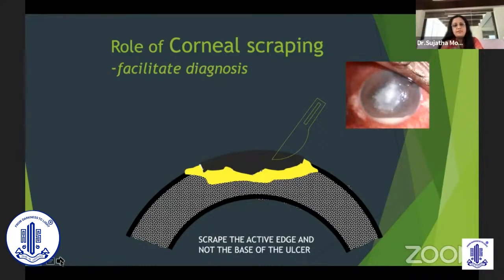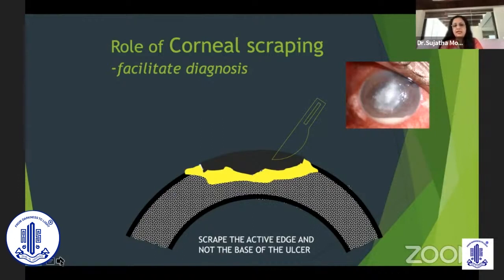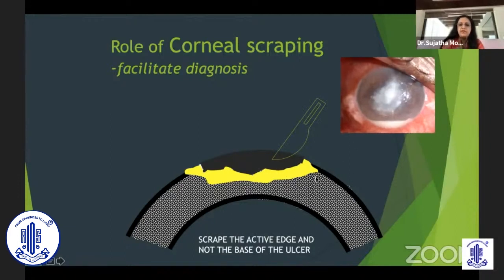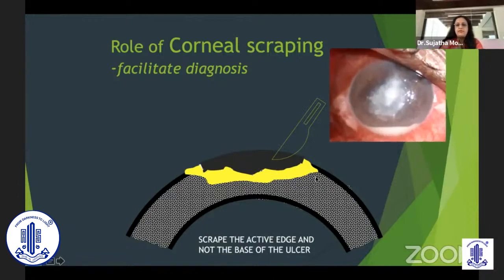The role of corneal scraping is very important to facilitate the diagnosis. It's important to scrape the active edge and not the base of the ulcer, because most often the base contains only slough. Except in certain organisms where the base may still have active organisms growing, the majority of active ulceration is at the edge of the ulcer, which gives us maximum information.